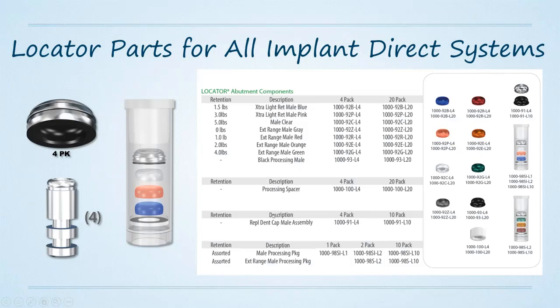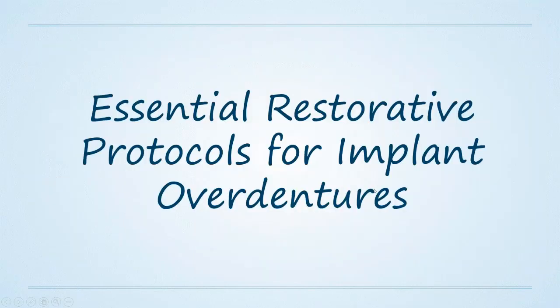Now, most clinicians order what's called the male processing pack, which is this little pack that you see here. The male processing pack includes the metal housing, the black processing insert right in here, and also includes 3 of the normal retention strength levels, so clear, pink, and blue, as well as the blockout spacer. So once we review how we work with our implant systems and the Locator abutments, then we can go ahead and talk about some of the surgical procedures, as well as maybe thinking slightly outside of the box for our Locator cases.